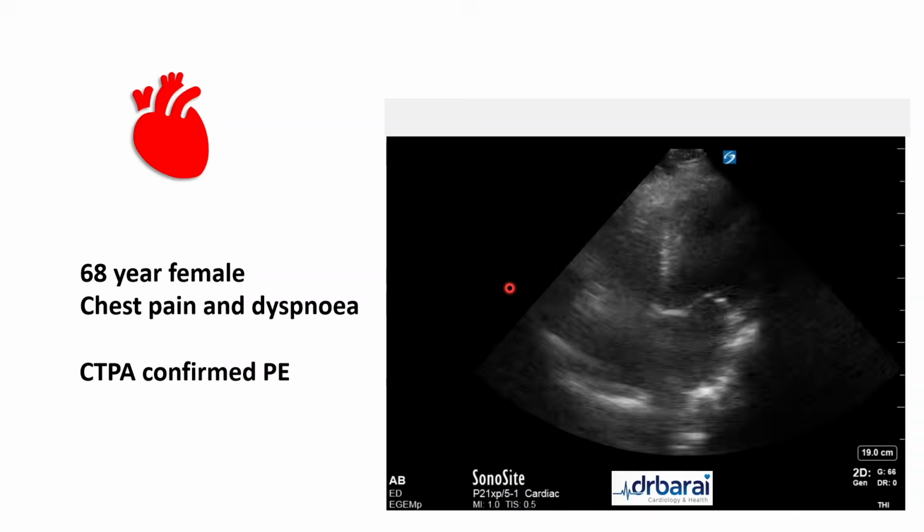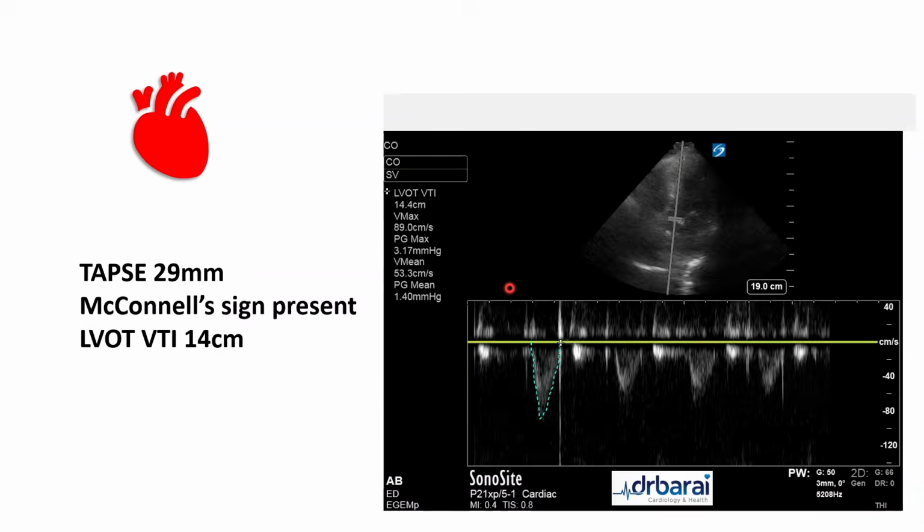So what I did is I started on the pulse wave Doppler, and I used the signal just below the aortic valve, and I got these waveforms. As you can see, just after the wave there is a vertical line, that means the aortic valve is closing. With the finger painting we can trace the edge or the margin of this waveform, and once we do that the machine can calculate what the LVOT VTI is.